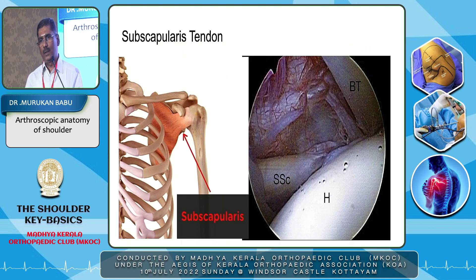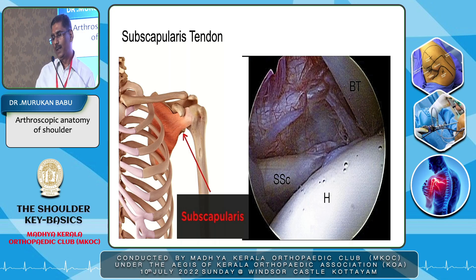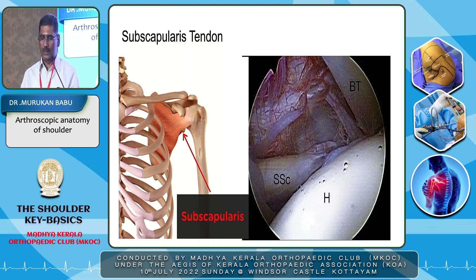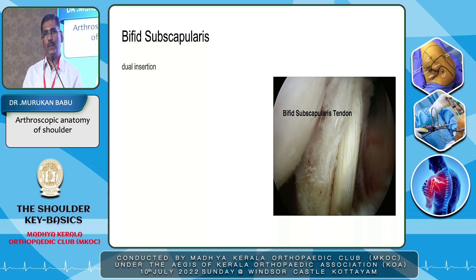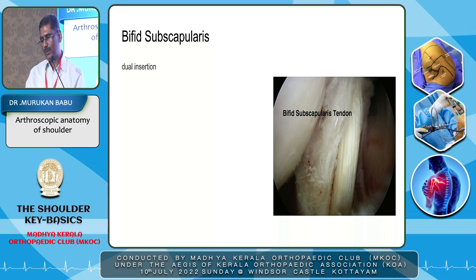Coming to the second part of this position — after the anterosuperior labrum, then the subscapularis tendon. You probe the subscapularis tendon in the intra-articular part up to the insertion at the lesser tuberosity. Sometimes you may see a bifid subscapularis — that is the dual insertion into the lesser tuberosity. You can see two bands, but sometimes you may mistake this for a torn tendon.